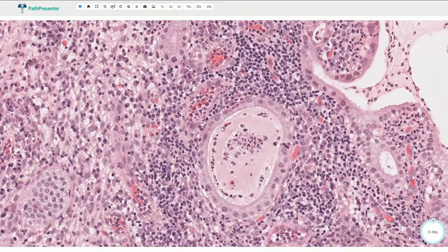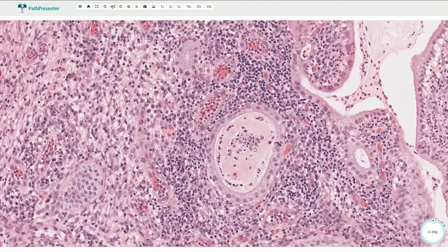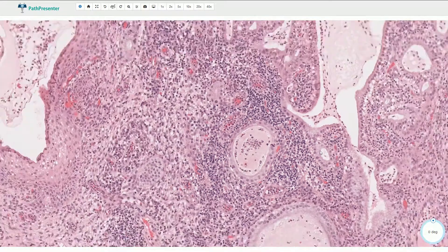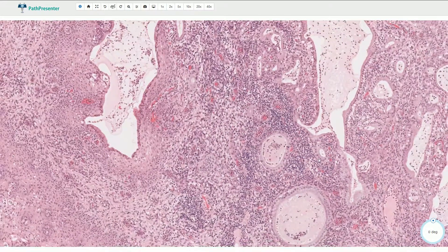Here we see the neutrophils inside of the endocervical glands, indicating acute inflammatory involvement.